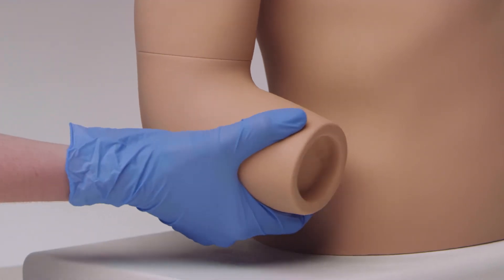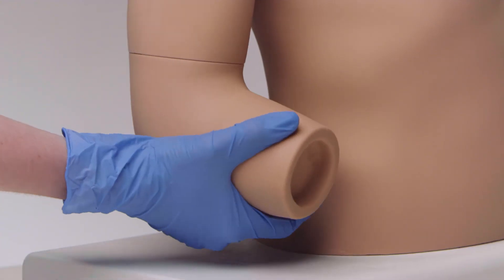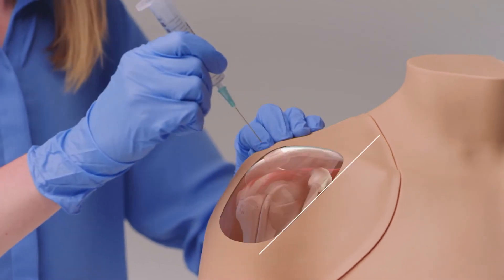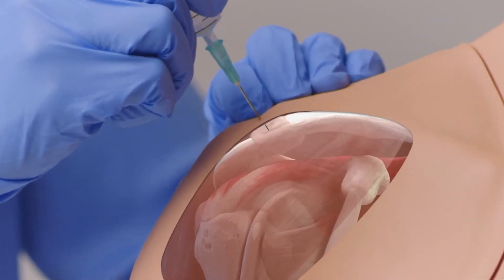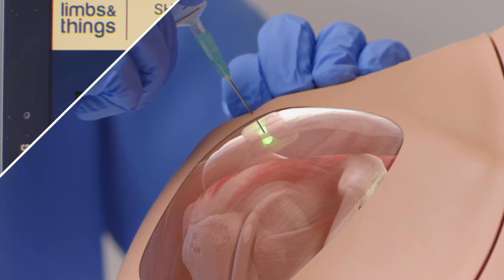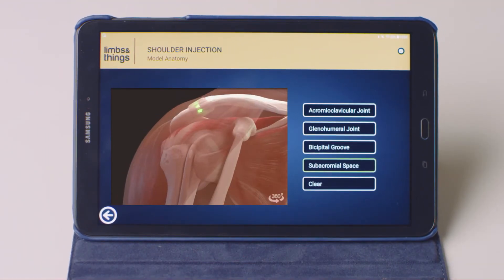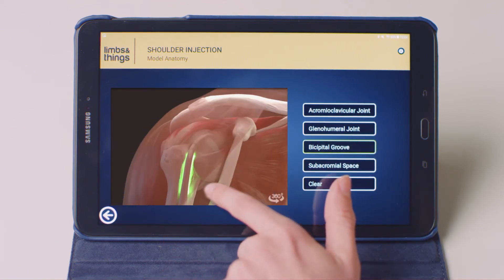Rotation of the shoulder at the elbow allows trainees to palpate for the head of the humerus. Using a standard needle, the trainee can identify when the site is correctly located with the help of a beep and a visual guide on the app. Trainees can view a simple list of injection sites, or the underlying anatomy, in a 360-degree rotatable view.